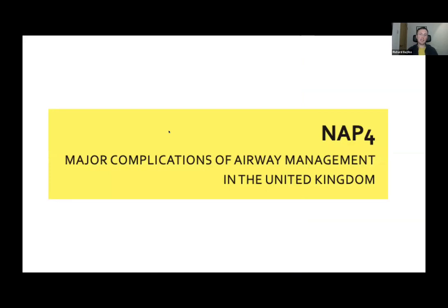And the relevant issue for us is that it highlighted the relative danger of intubation outside the setting of the anaesthetic room. So thinking about emergency department intubation, critical care intubation, there's a higher rate of adverse events, and the morbidity and mortality associated with those events was also higher. Now, that's partially a result of increased acuity. You have a limited ability to formally assess the patient before you intervene and anticipate those airway management difficulties, and that kind of unplanned nature of the airway intervention that happens in those areas.